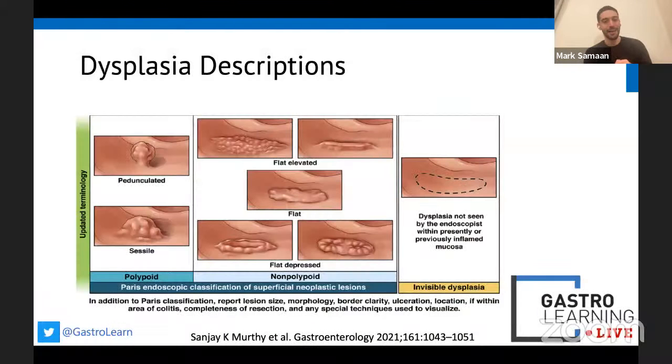In the absence of polyps or pseudopolyps, there was this entity of visible and invisible dysplasia. I often hear Boo Hay down at King's, who's obviously fantastic at this kind of thing, saying that there really is no such thing as invisible dysplasia, and if you have someone with the right eyes, the right techniques, the right scope, they will see it.